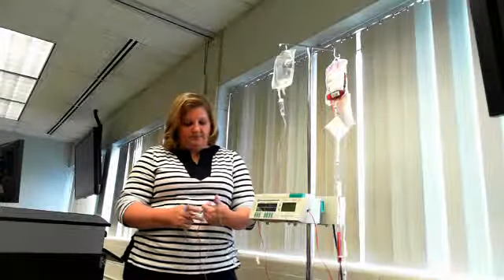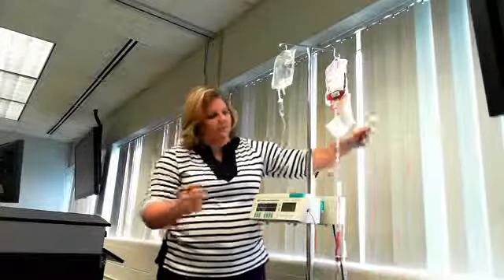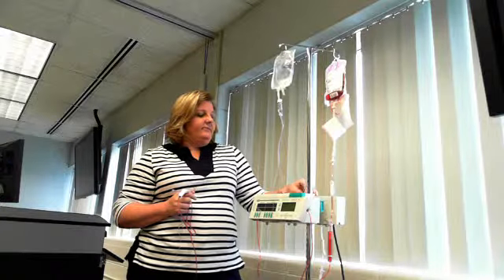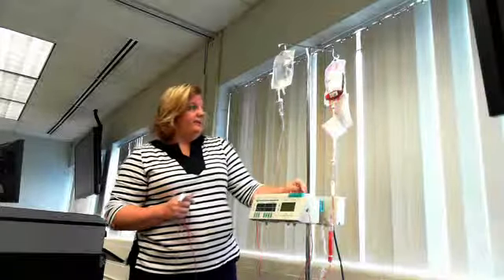Once the 20 minutes is up, you will have taken vital signs once every five minutes for a total of four times. After that, monitor vital signs once an hour until the transfusion is completed. If the patient has any signs or symptoms, they should let you know — constantly ask them. Also, if they feel the IV is giving them trouble or they notice swelling at the site, tell them to notify you immediately.